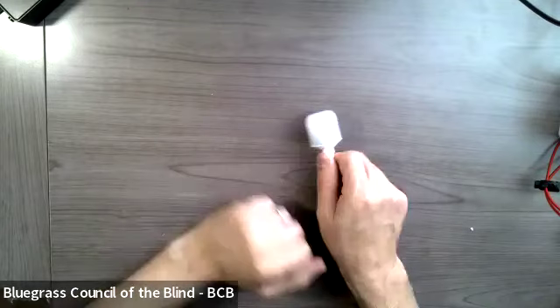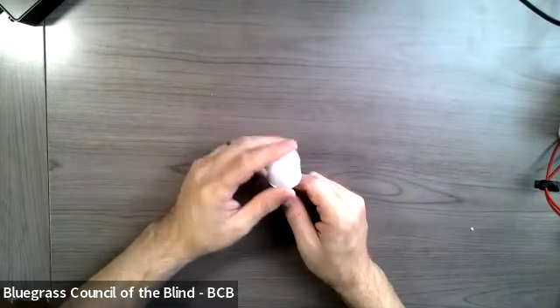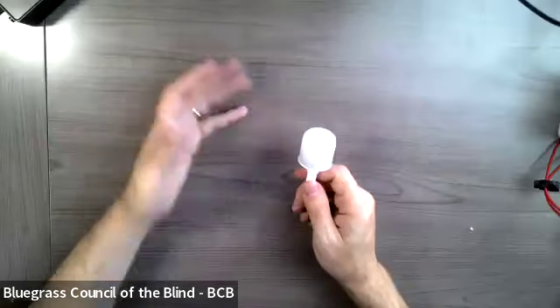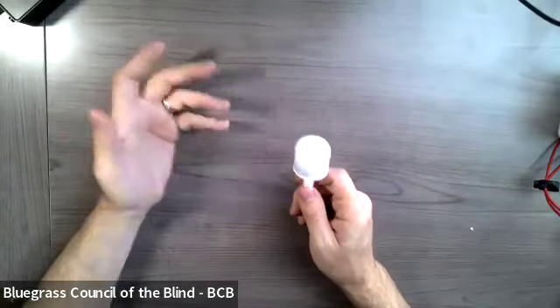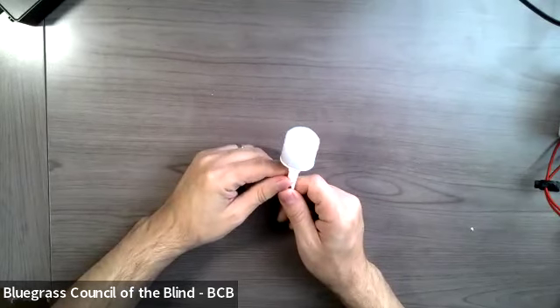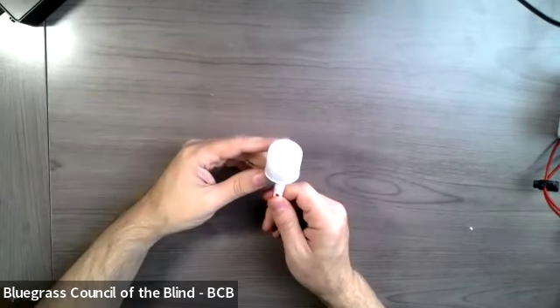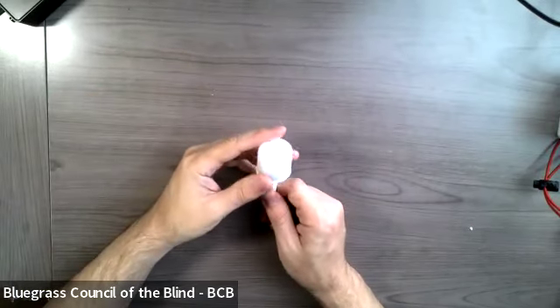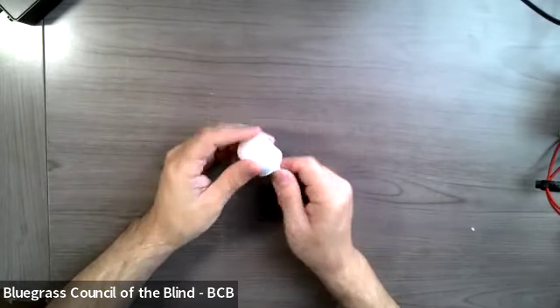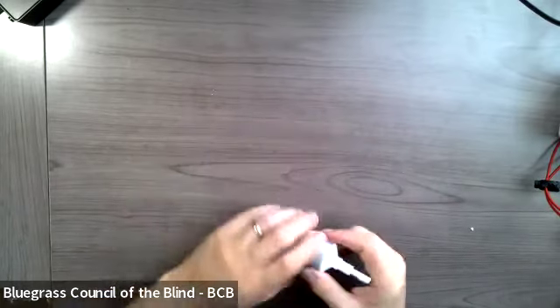But the rolling marshmallow tip, it's not too big, so it's not going to be heavy, but it's large enough that it's going to roll over most obstacles like tree branches, cracks in the sidewalk, things like that. So this is generally why most people prefer a marshmallow tip. If you're not sure what tip to get, I would get a marshmallow tip. This particular one is also called a high mileage tip, which means that it's made from a more durable material and will last 2 to 3 times longer than your standard marshmallow tip.